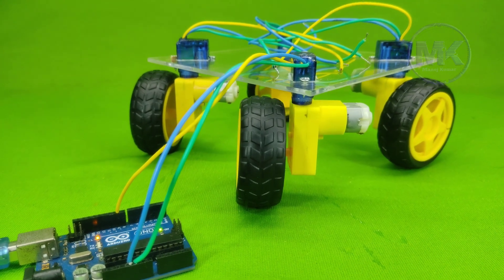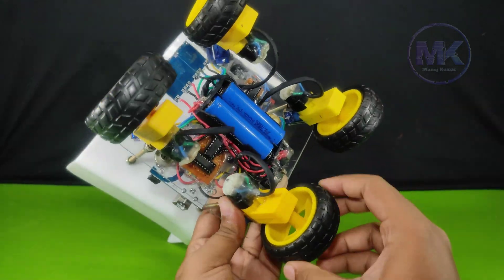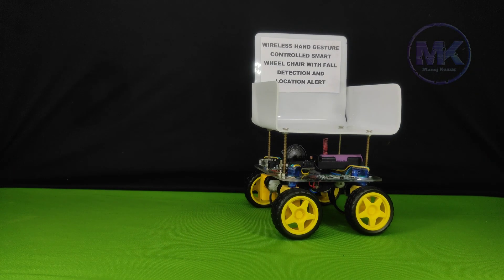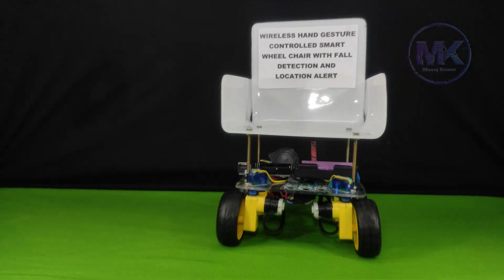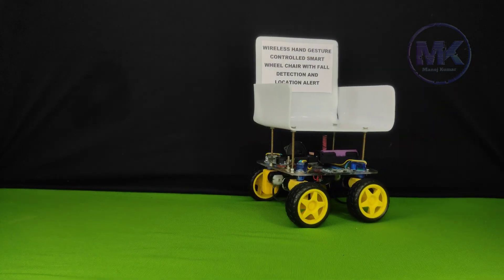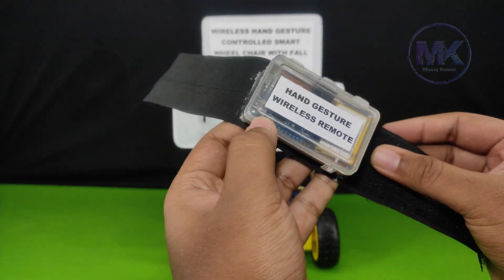Another interesting feature of this wheelchair is that it is constructed with an omnidirectional wheel rotation mechanism. By using this advanced mechanism, the wheelchair is able to move in any direction with a fixed position. The wheelchair is controlled by using a device called the hand gesture wireless remote.